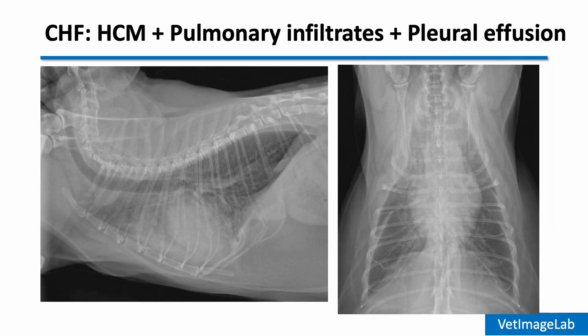In this case, pleural effusion is more prominent. You can see widened interlobar fissures and retraction of lung lobes, along with pulmonary infiltrates. This represents advanced congestive heart failure with significant pleural effusion.